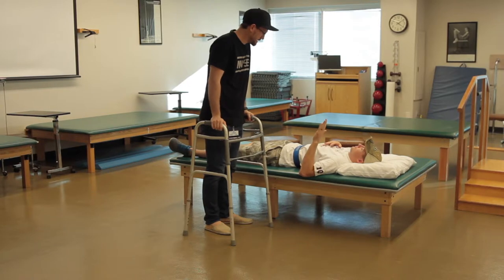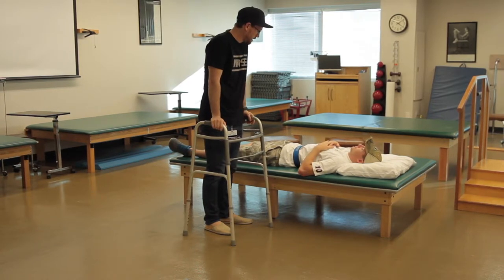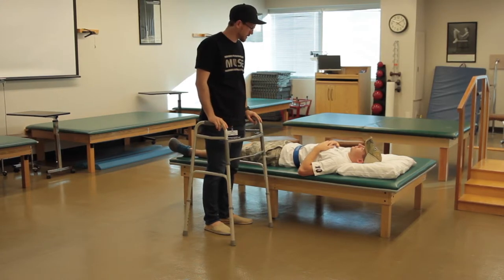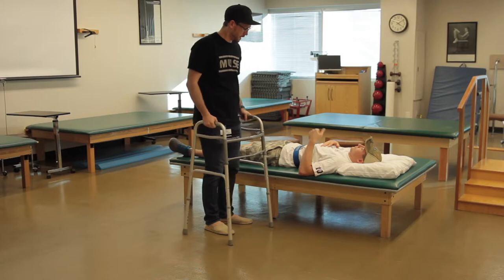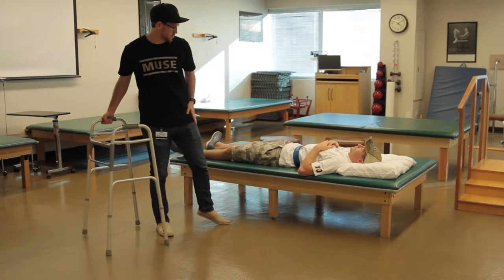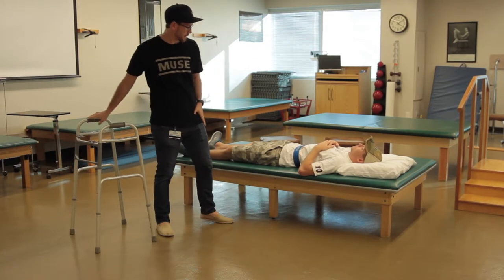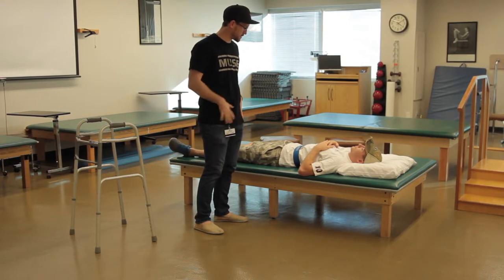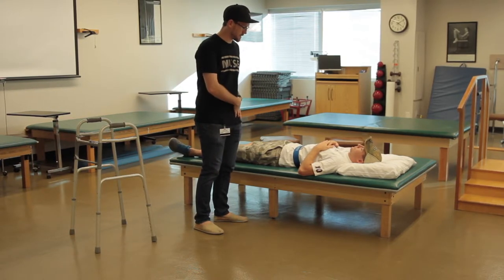How's it going today? Good. Great. So what we're going to do today, we're going to get you out of bed and I'll teach you how to use this walker. Does that sound okay with you? Alright, so you had a left hip surgery, is that correct? Yeah. So I'm going to teach you three rules that you have to adhere to while we're here, just so that we preserve that surgery that we did.